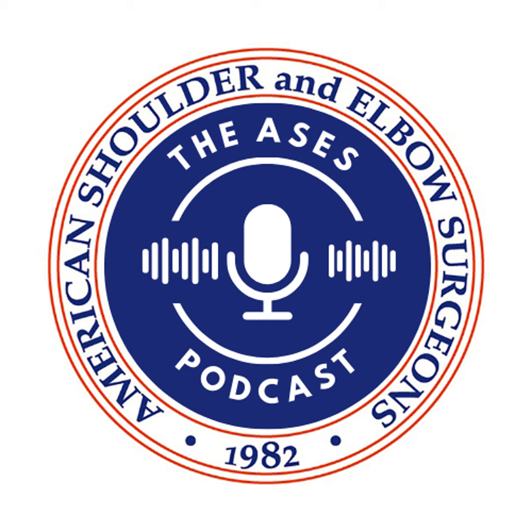Yeah, I think they echo some of what Joe said and some of the thoughts I said before, which is I think we just adapt to our different systems. I have a system that right now I can actually use augment on the fly or just use a regular base plate. And sometimes I do, and sometimes I don't. And before, I used bone graft. And again, my goal was to tilt it down. We can talk a little bit more about how far, but I think we as surgeons get to a place the way that we know how to, and we adapt accordingly.